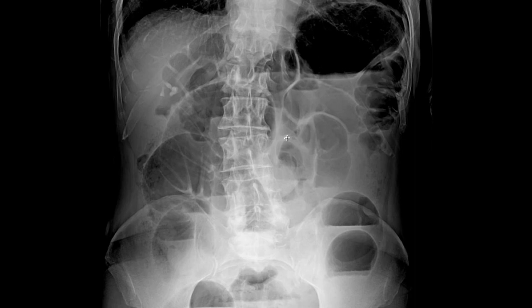So the 3-6-9 rule indicates the maximum normal diameter for the small bowel should be 30 millimeters. That is 3 centimeters. So when you come to measure the small bowel, the normal size will not go beyond 3 centimeters. Okay? When it comes to the large bowel, it's 50 to 60 millimeters. That's 5 to 6 centimeters. Sorry, mind my math. Okay.